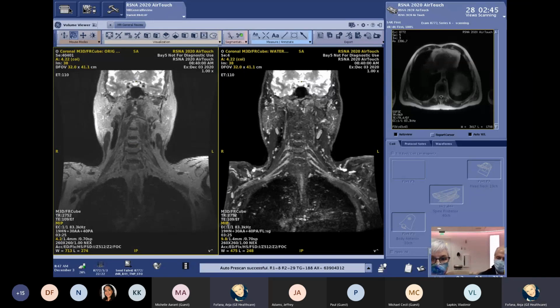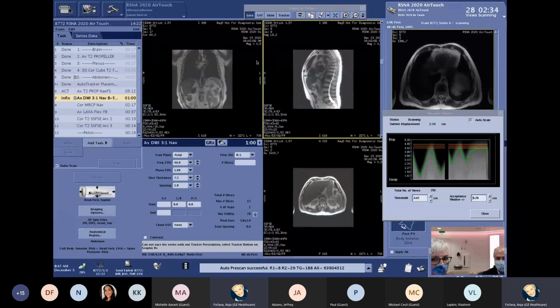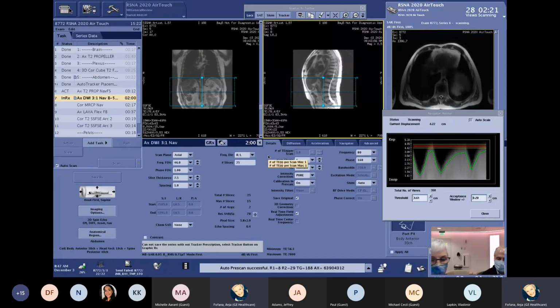The Cube has a lot of compatibility, really, with multiple different types of tissue contrasts. You can do a T1 Cube, T1 FLAIR Cube. You can apply Dixon to those. You can do T2, T2 FLAIR, IR. So it has a lot of versatility in how it can be used. Yeah, that's really the nice thing that Cube, any contrast you can think of can be done with Cube. So here's maybe something good happening, what is happening in real life too with our navigator.